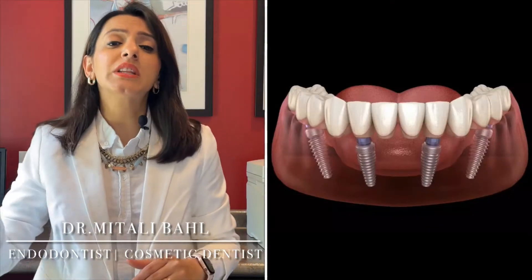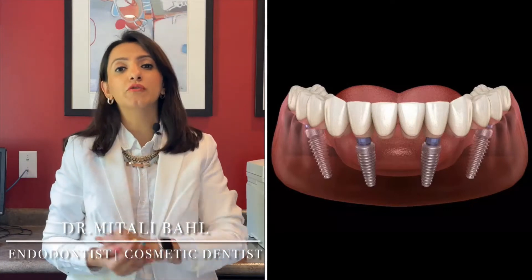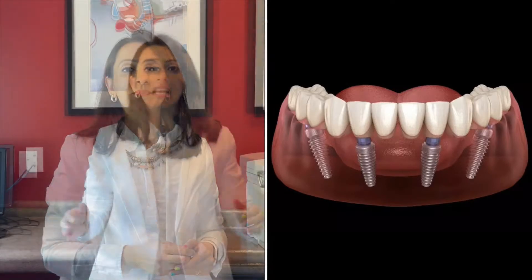Dental implants have undoubtedly become an integral part of dental practice, growing in popularity with an increasing number of people around the world opting for it — arguably the best solution for people with missing teeth. But as straightforward as the procedure might look, dental implants pose some real challenges, risks, and possible complications.